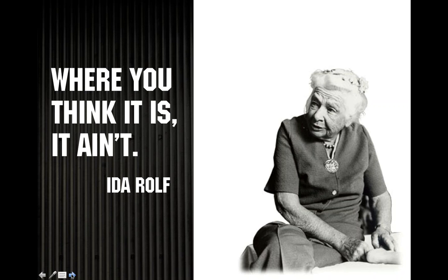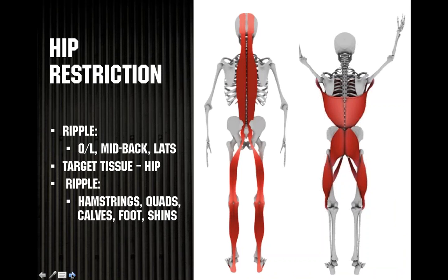With tooling, we do it relatively the same. For instance, let's look at hip pain. What's going on with hip pain? Is the hip moving adequately? Is it seeking stability? Is it seeking mobility? Within our class, we talk about that. And then if we don't get the outcomes we want, well, did we treat the fascial chains above and below? So the same idea, joint by joint, but also the fascial system too. If I'm looking at this posterior line right here, and somebody has some hamstring pain, am I treating the hamstring? But am I also treating gastroc tissue and maybe paraspinal tissue? I can go that far apart.